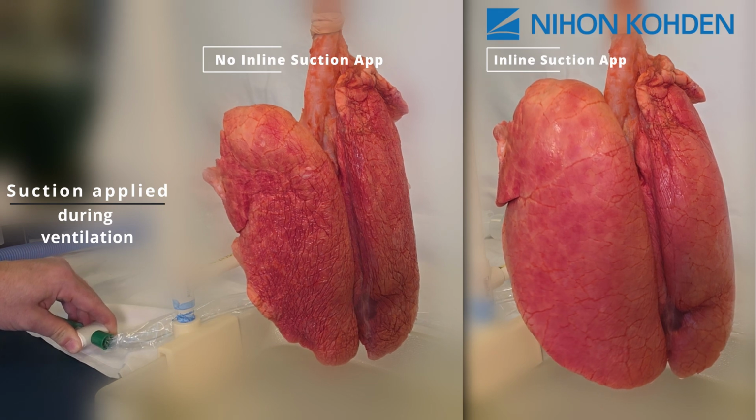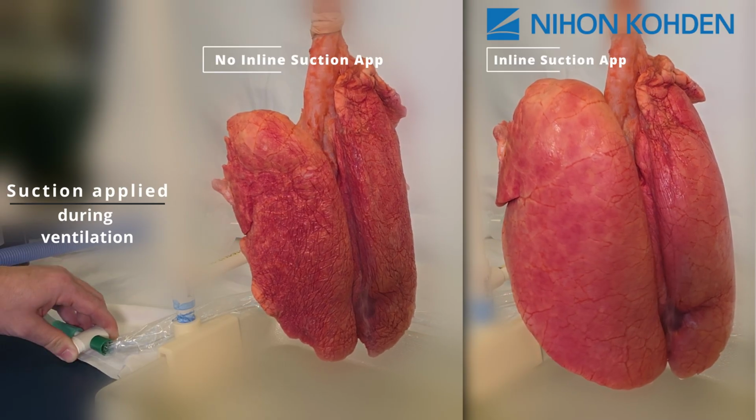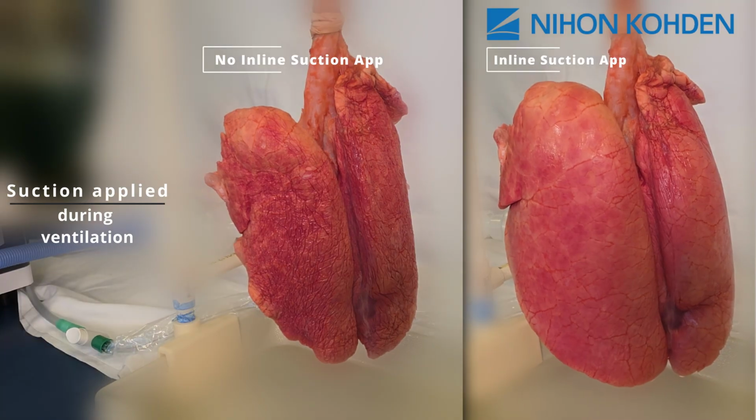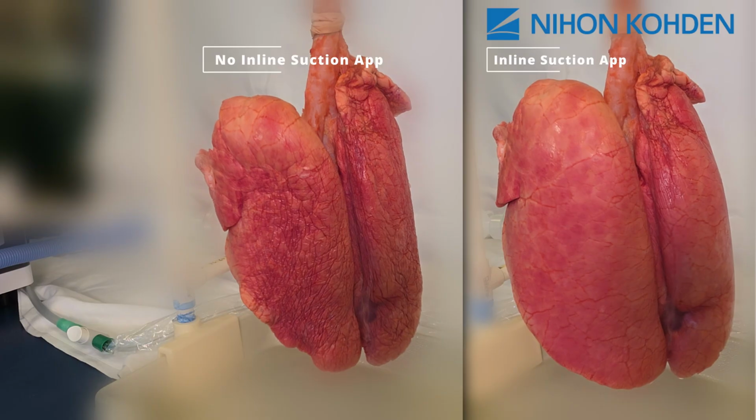Utilization of the Inline Suction App helps maintain lung volume and prevent derecruitment of alveoli. We can visually observe the impact of open lung units during suctioning when using the Inline Suction App compared to suctioning without the app.